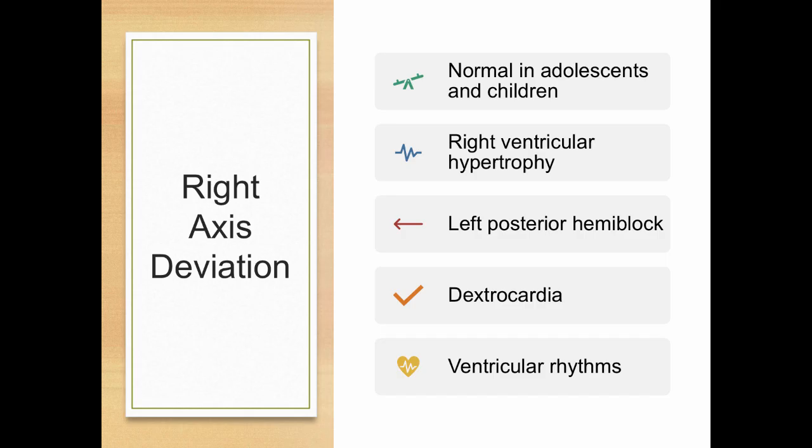Might be dextrocardia, a big fancy word that means your heart is on the wrong side of your chest. So you're kind of looking at the opposite view of it. Hopefully, the patient knows that they have dextrocardia and can tell you. If they are unconscious and can't tell you, you might see this and think something weird is going on. But every dextrocardia patient is going to know that they have dextrocardia for the most part.